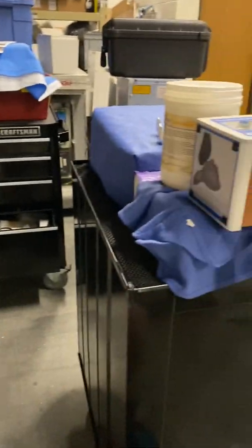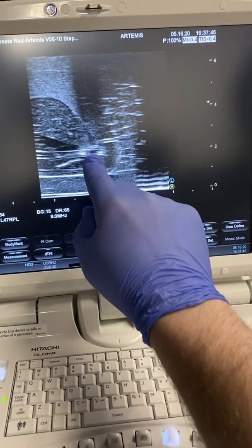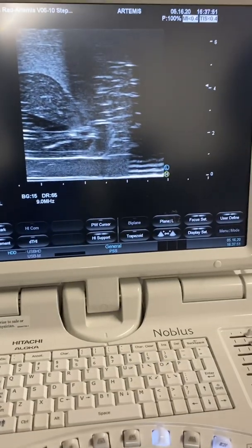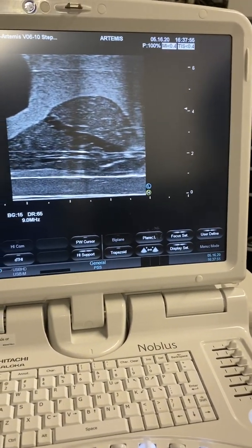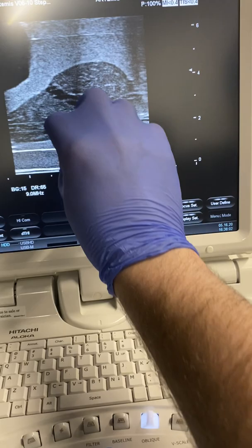For SpaceOAR, you want to go down - you want to decompress the gland a little bit. The reason being, we want the space to open. If you can picture the rectum on a real patient, you want the space between the prostate and the rectum to open, because that's where they're aiming. SpaceOAR is basically a gel that once injected, it's going to expand that space between the rectum and the prostate.